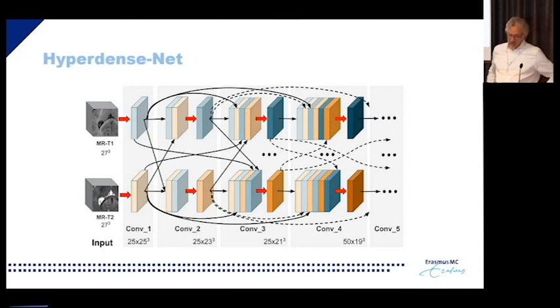Okay. Also starting then with the hype word, deep learning AI network. How does it work in the imaging field? Well, there is input. On the left side, there are a lot of layers connected. And all those layers do a kind of processing on the data. Normally just going to a lower resolution, averaging some parts of the image, looking more to edges, looking more to intensities, and at the end you get an output, and the output can be a decision, like it's a pig or a dog, or it can be an image again, like label data, for example. So we use this to segment the brain of the data into gray matter, white matter, and CSF.